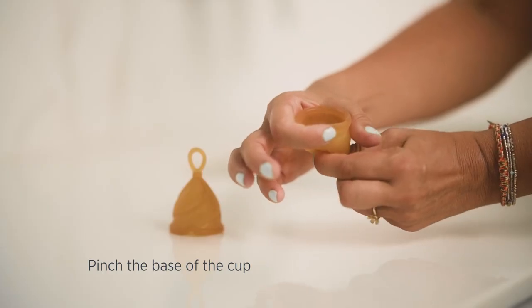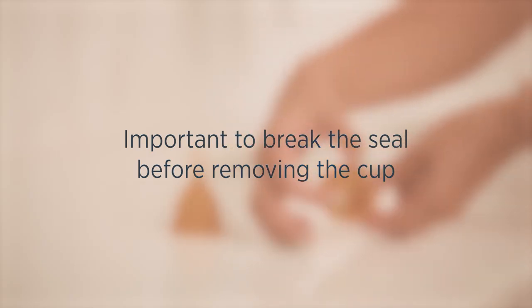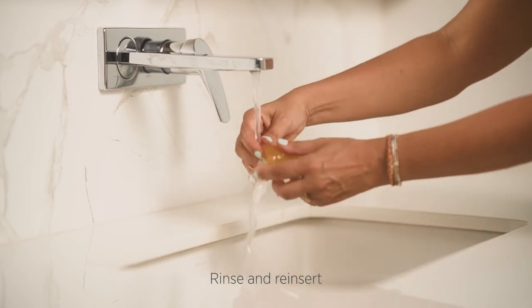To remove your Loop Cup, firstly pinch the base of the cup to break the seal, and then pull the cup by using the Loop. It's important to break the seal before removing the cup. Empty in the sink or in the toilet, then rinse and reinsert.